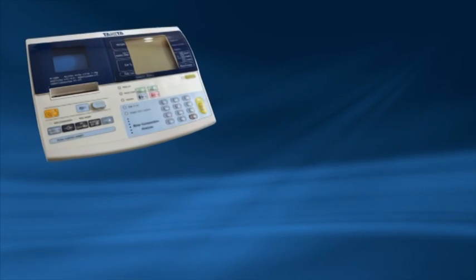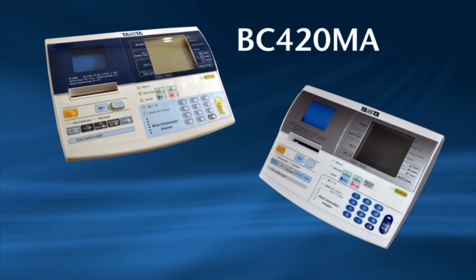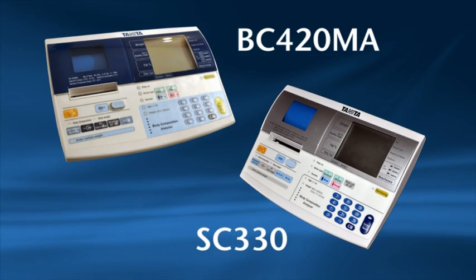Thank you for purchasing a Tanita BC420MA or SC330 body composition analyzer. In three easy steps this video will help you set up and operate your analyzer as well as explaining the measurement readings. Please note all the instructions for both models are the same.